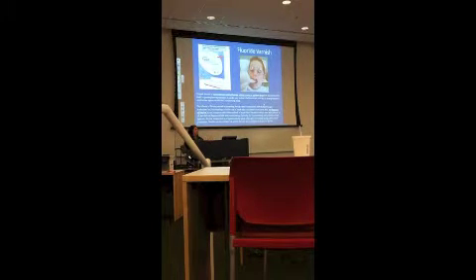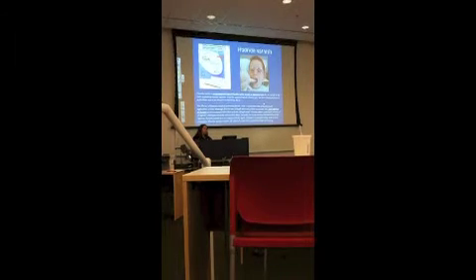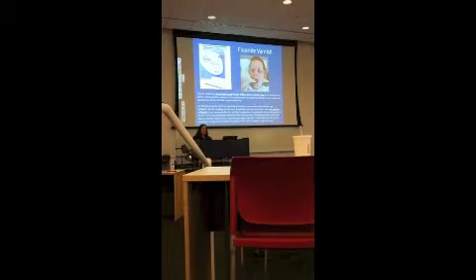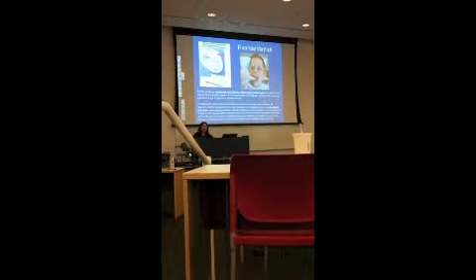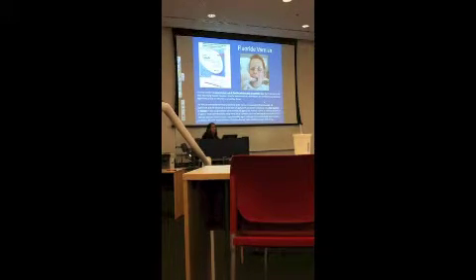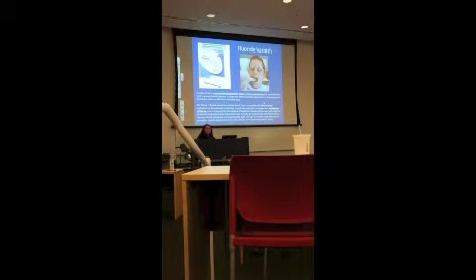So you have your PPEs on, the patient's ready, everything's ready, and you can lean the patient back in a supine position, and you can apply the varnish. You're going to peel off the protective cover. Let me see if I can turn on the camera so we can see this on the monitor.